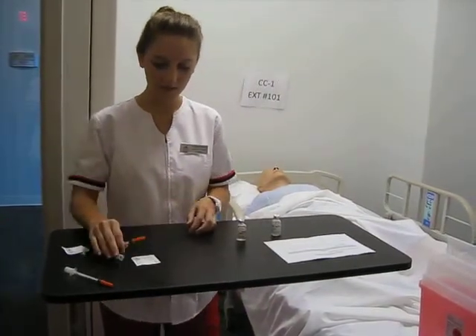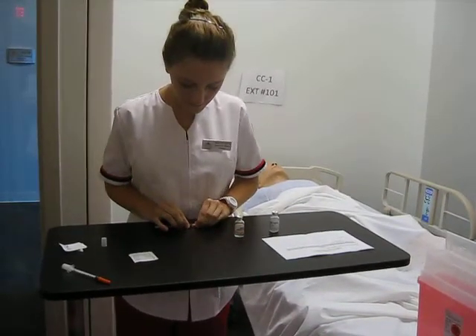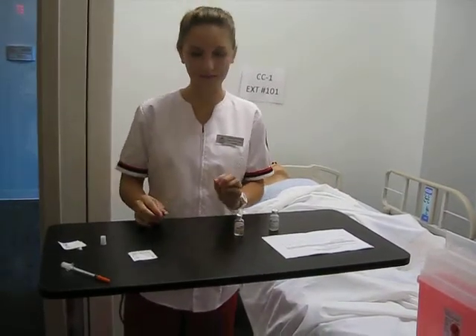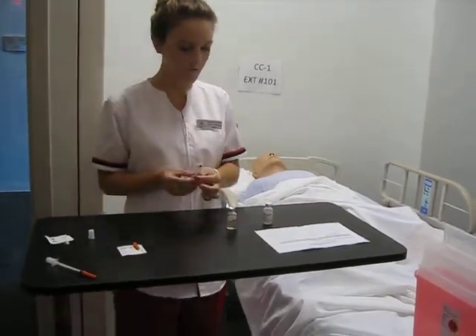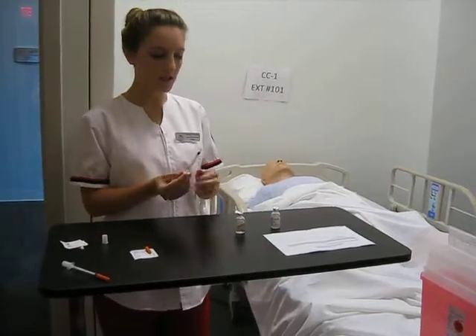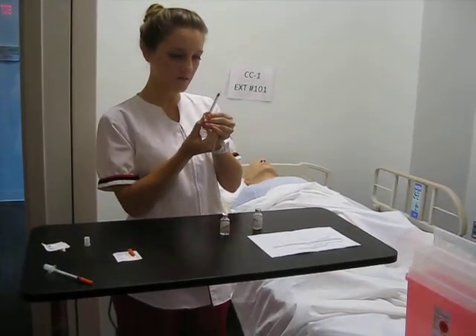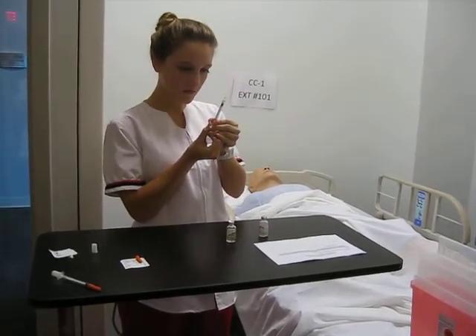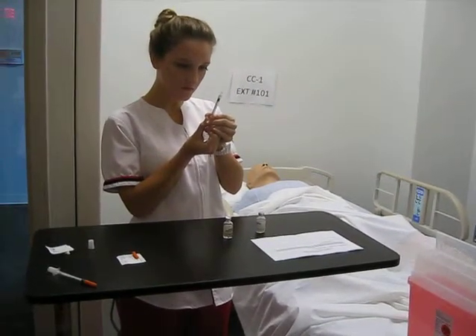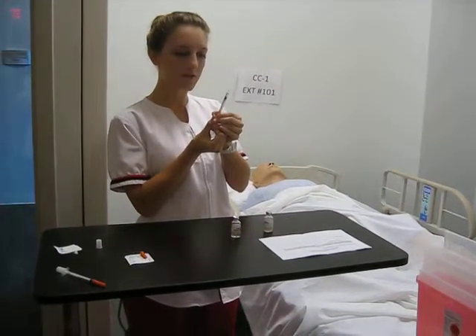I'm going to safely uncap my needle, and I need to place this somewhere where it will not get contaminated. First, I will need to do my NPH, which is 22 units. So I'm going to put in 22 units of air.